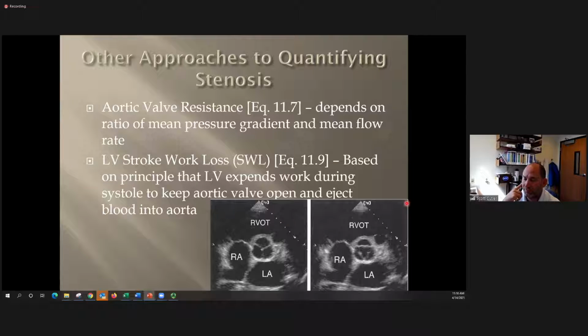So is it fully open like we normally see? Maybe not quite, but this is if it is stenotic, and you would only tell that by the velocities. This is not a very super stenotic one. This would be like a mild at best if it's elevated velocity. The one on the right is just a closed valve. I'm just trying to show the difference between the open and the closed valve, what you should see. If it's not that nice triangular shape, you're probably getting a stenotic situation.